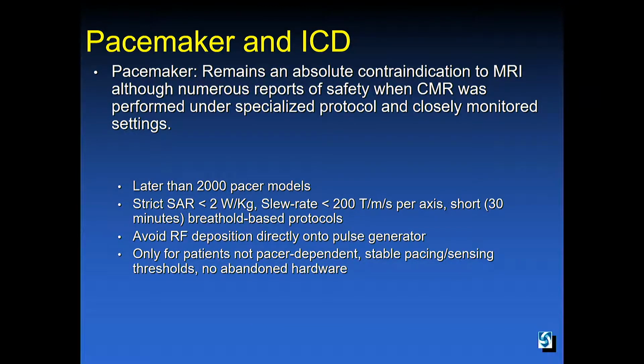Now, other situations in which you should be somewhat cautious about performing cardiac MRI is the presence of a pacemaker or ICD. Many models are still considered an absolute contraindication to MRI in inexperienced centers, although there are many reports that these so-called legacy pacemakers are safe.